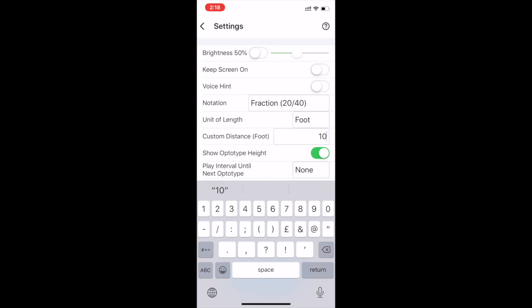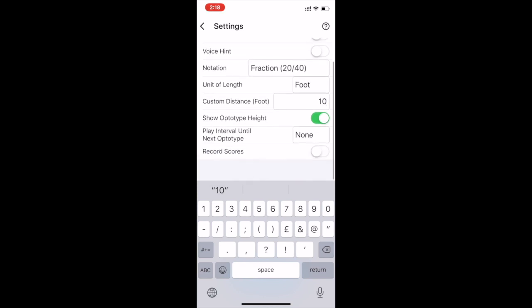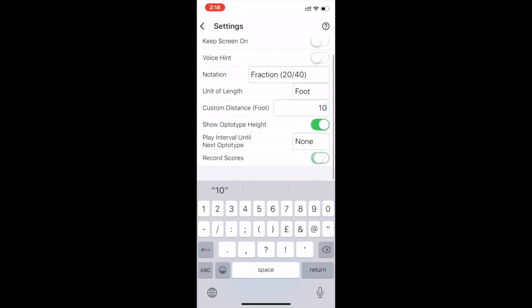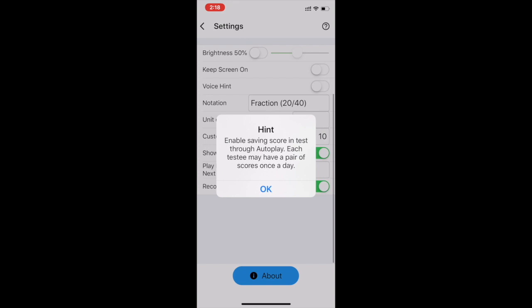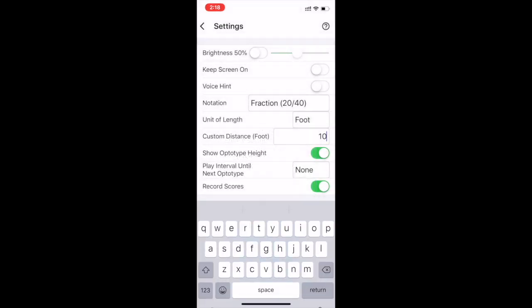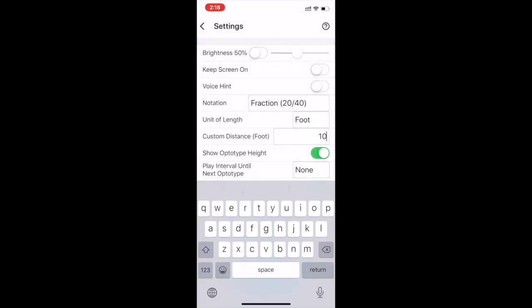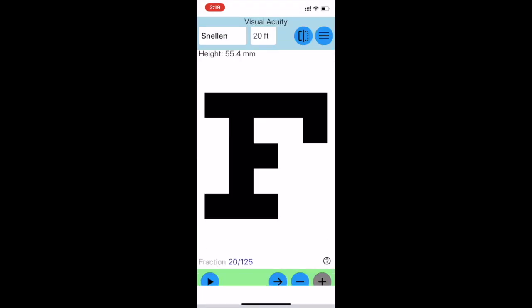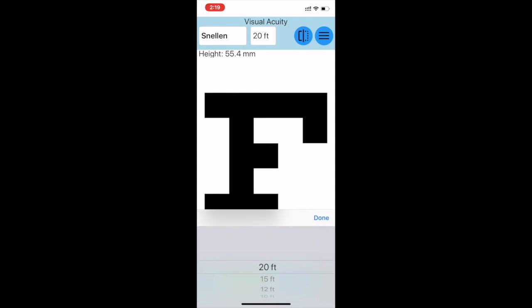Then to return back to the main menu, press the Settings button on the top left of the screen. Finally, change 20 foot to 10 foot, then press Done.